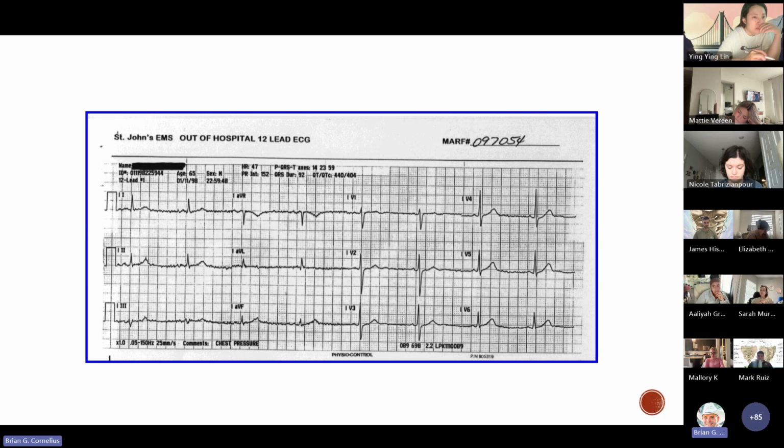Commonly now in large facilities, this is done for you, but you may see if you're working in a surgery center or maybe an office-based practice that you're the one that actually has to input some of the data or even do the test itself. So make sure you don't take shortcuts, especially since those tend to be older machines that may not have some of the newer technology.